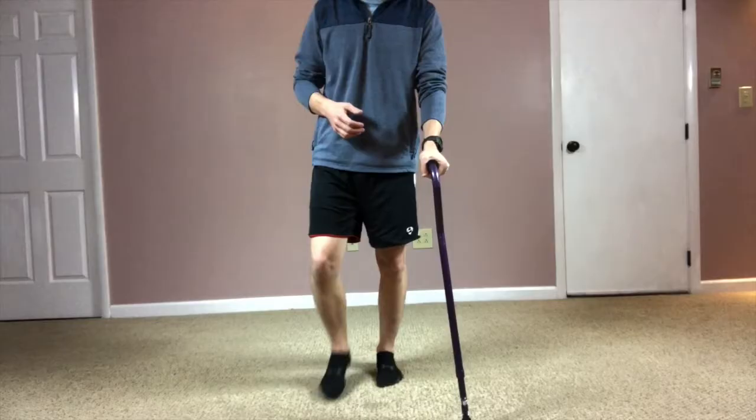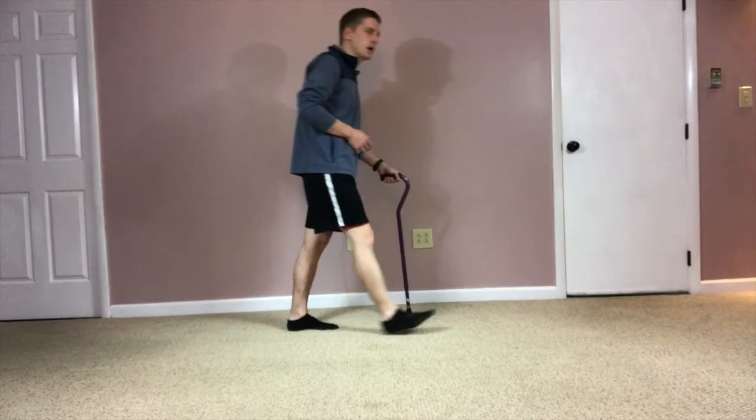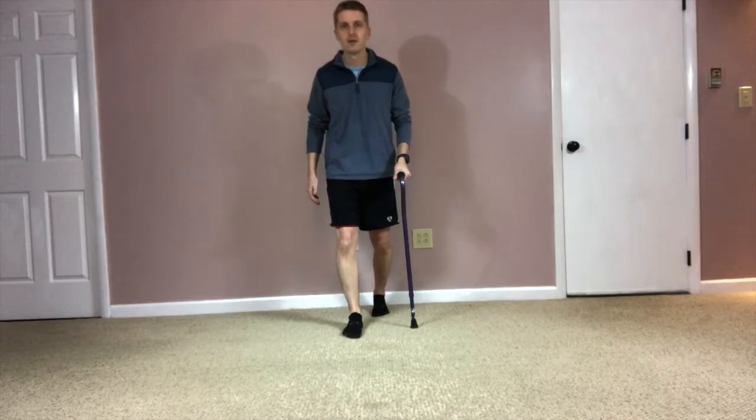Now this is, again, for someone who has more mobility limitations, can't walk as much with that normal pace. As you can see, it's a little bit slower, a little bit more technical, a little bit more mental gymnastics. For the vast majority of people, though, it's going to be that first way. So it's going to be cane and surgical leg together, and then opposite.